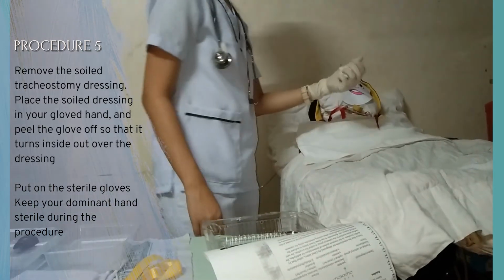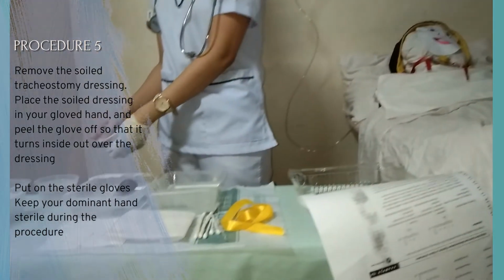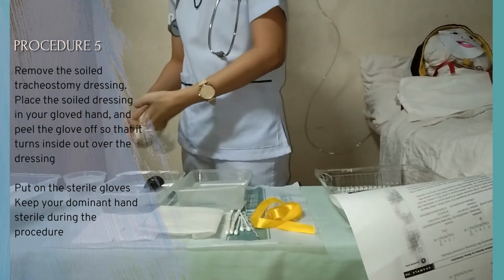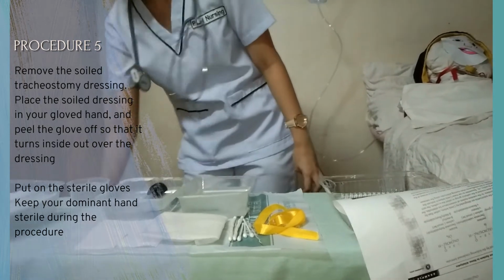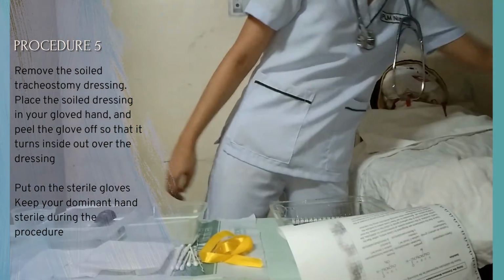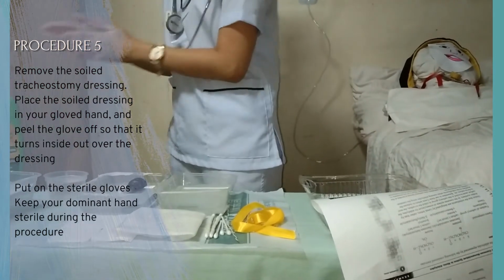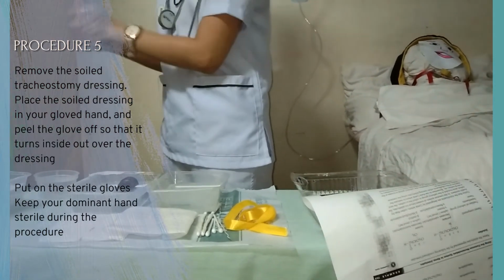Remove the soiled tracheostomy dressing. Place the soiled dressing in your gloved hand and peel the glove so that it turns inside out over the dressing. A soiled dressing is a good medium for bacterial growth, and replacing it should reduce risk of infection. This is also to contain the secretions inside the glove and reduce transfer of microorganisms.